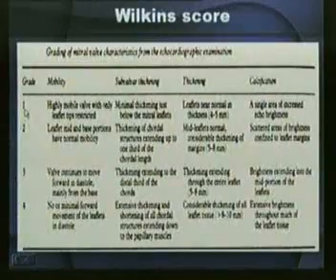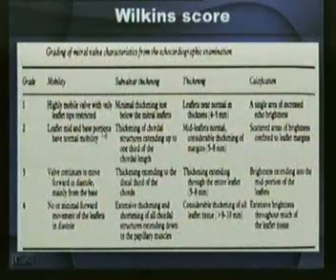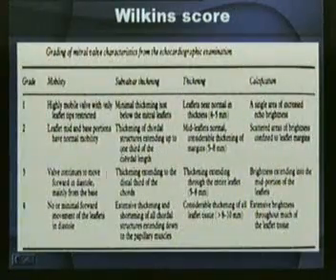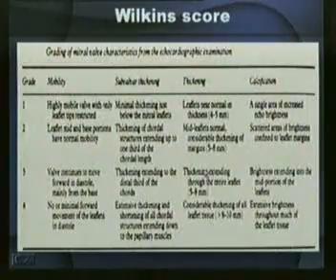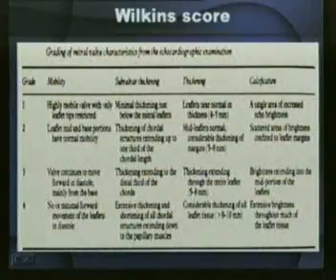Let's say grade 1, when you talk of mobility, mobile valve. Grade 2, mid and basal portions have normal mobility. Valve continues to move forward in diastole, mainly from the base, with no or minimal forward movement of the leaflet. And this is how it goes. Subvalvular thickening, thickening of the leaflets, and calcification. If there is a single area of increased echo brightness, don't worry. You can still send the patient for a BMV.